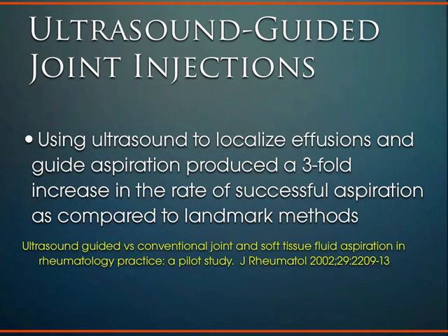But it's fairly blind, and you'll realize once you start using ultrasound guidance for injections and then have to go back and do blind injections, which I had to do after fellowship, it's a little unnerving because all of a sudden you can't see where the needle is or where you're going. Ultrasound is really very useful because it's real time.